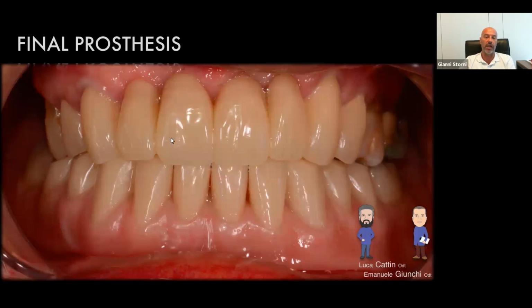And this is how it looks in the mouth. So that is, in my opinion, one good aesthetic result, made in a very easy, traditional way, not CAD-CAM needed. So, in my opinion, we have to be satisfied: we save cost, but we are not going to compromise aesthetics.